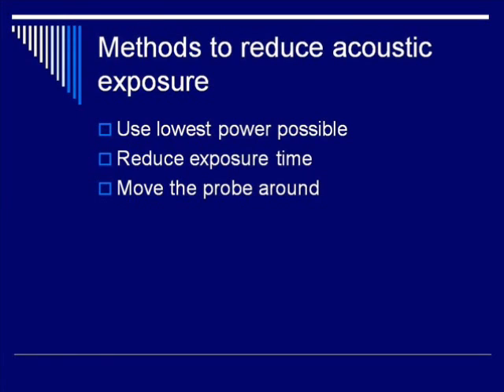Reduce the exposure time as much as possible. Minimize the time that the probe is on the patient. And recall that many of these effects are localized, so move the probe around. Use different windows.